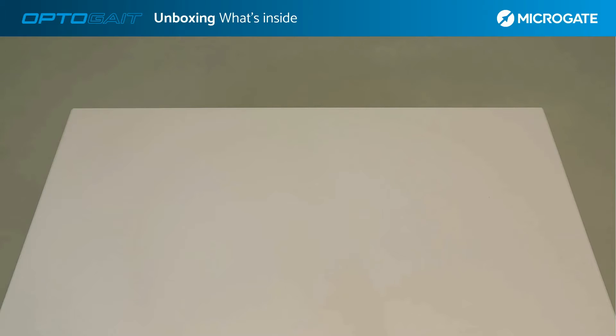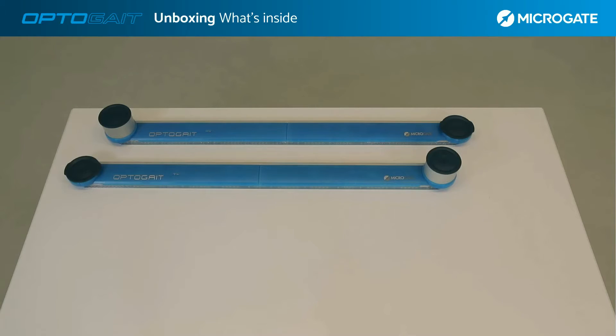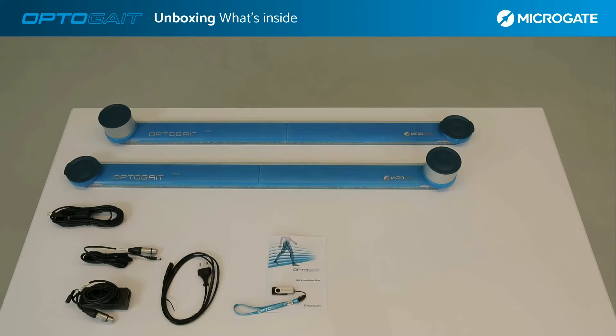The single meter kit bag contains the OptoGate bars with interface — the receiving bar and the transmitting bar respectively. In the bag we find the connection cable to the computer, two cables for powering the bars connected in series, a cable to connect the bars to the transformer and then to the power supply. A quick guide about the first startup is available, along with a USB stick containing the user manual and software installation kit.